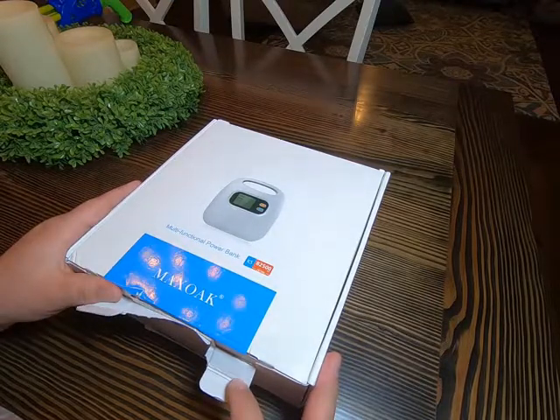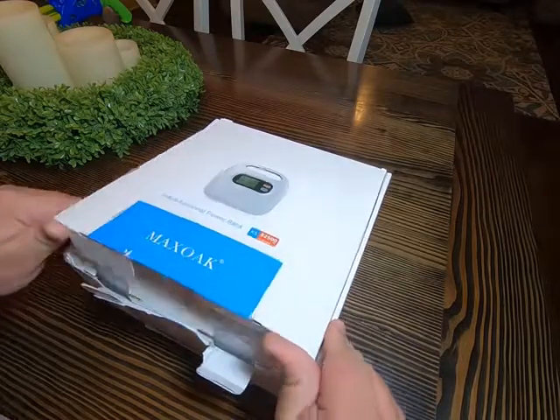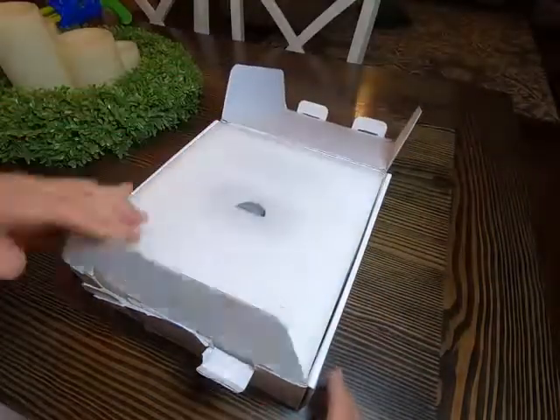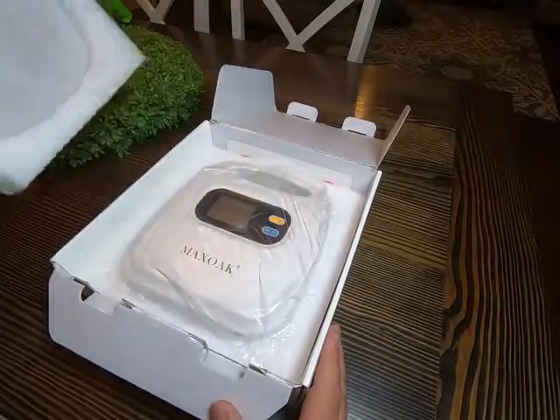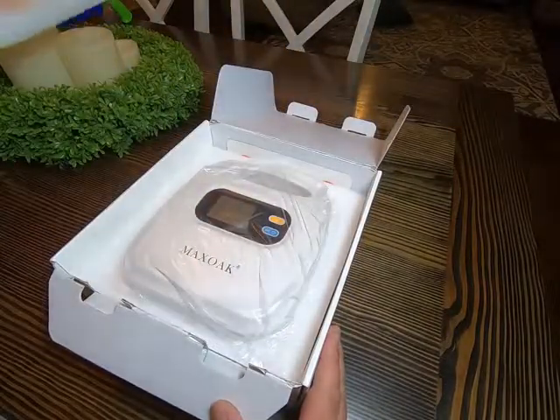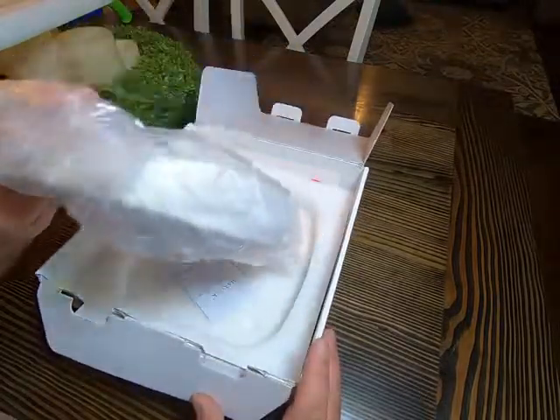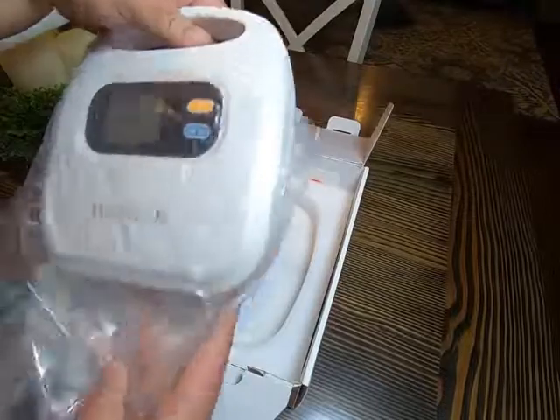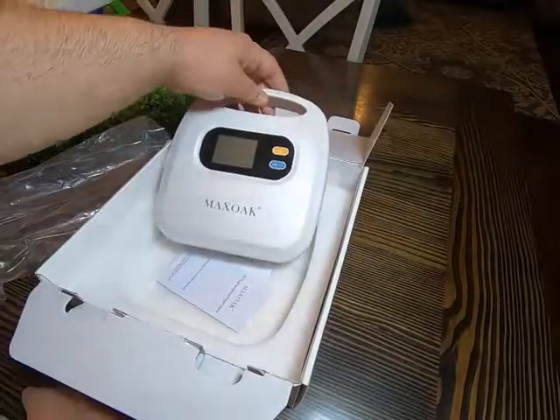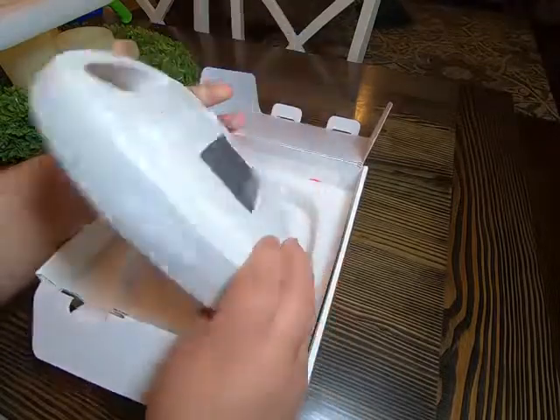I cut it open earlier but haven't really dug into it yet. It seems to be packed pretty well. It's quite a bit lighter than I thought it would be and seems to be really well-made — it's got a nice finish on it.